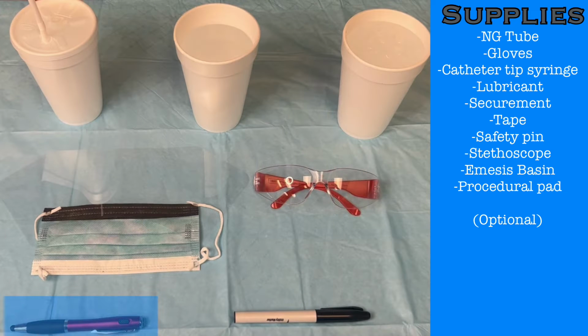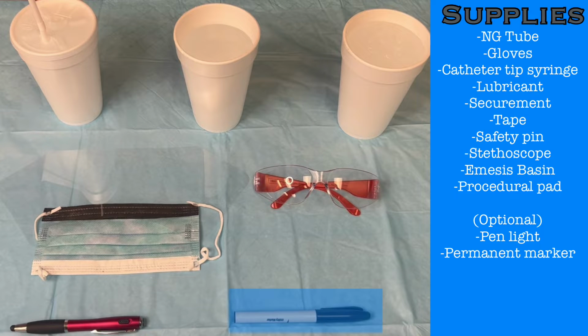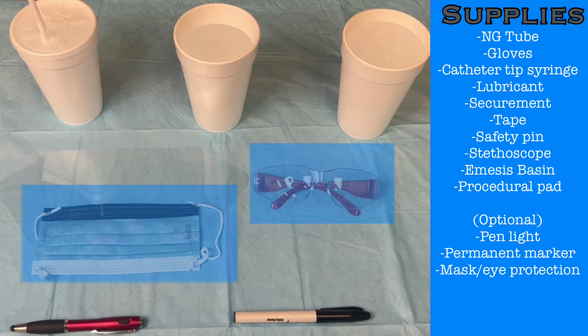Optionally, you may also want to have a pen light, a permanent marker, and more extensive PPE, such as a mask or eye protection. I have placed many NG tubes in my career, and being on the receiving end of projectiles from coughing or vomiting is bound to happen to you eventually, so I highly recommend the added PPE.